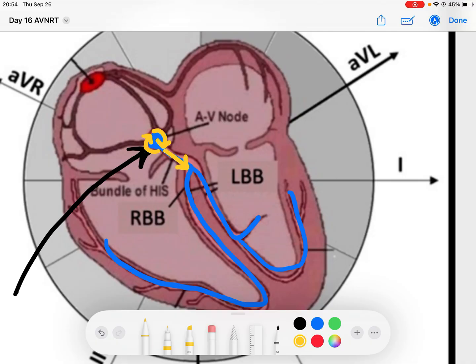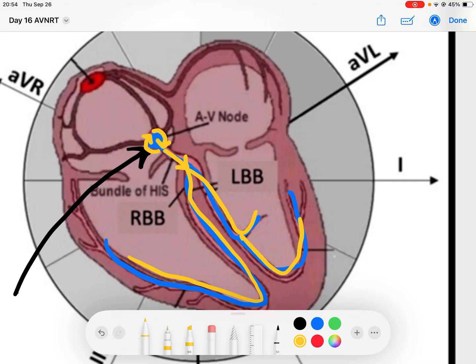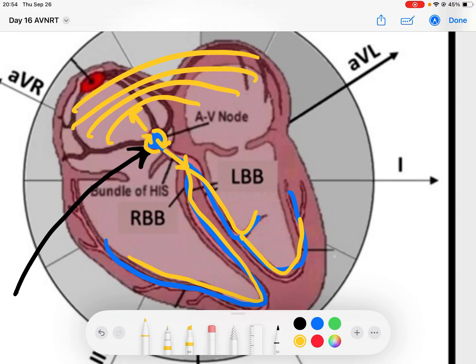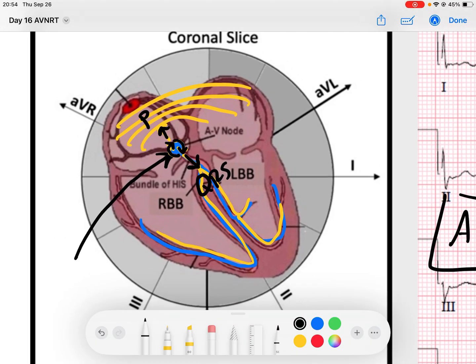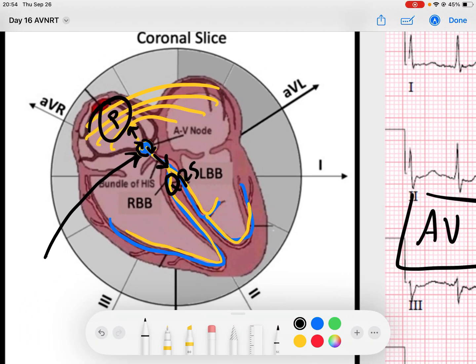Every time signal goes down anterograde, it conducts to the ventricles. Every time it goes up retrograde, it conducts to the atria and depolarizes them. What ends up happening is you get almost near-simultaneous signals — one going down creating the QRS, and one going up creating retrograde P waves — so these P waves and QRS complexes merge together.